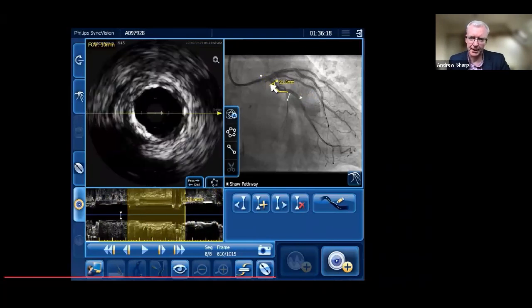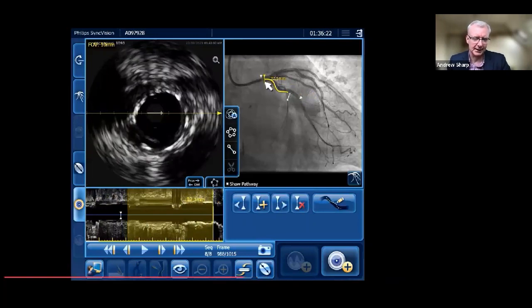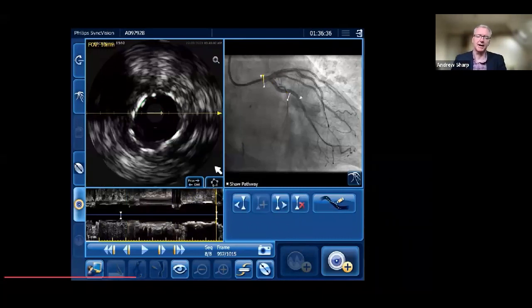Stents are all nicely on the wall. As we come back towards the distal left main, again, it's a touch on the small side, and we'll need to fix that, and we do. We take another balloon and optimize that. But what's interesting is even with a 5.5 balloon, we've only got the stent to go up to 3.5.